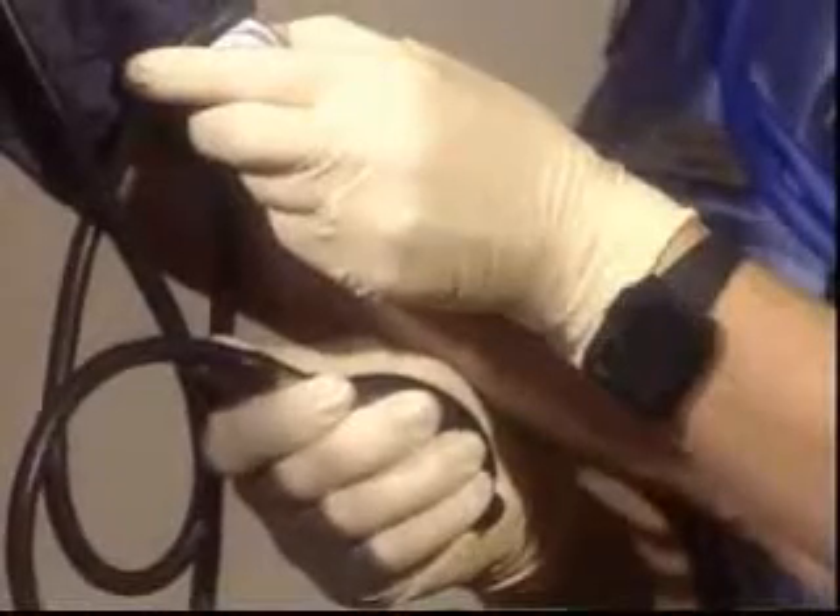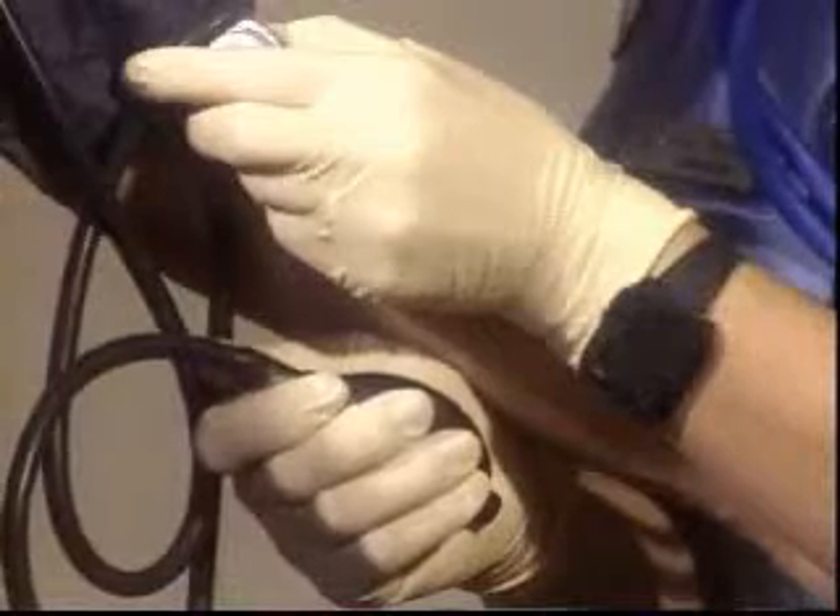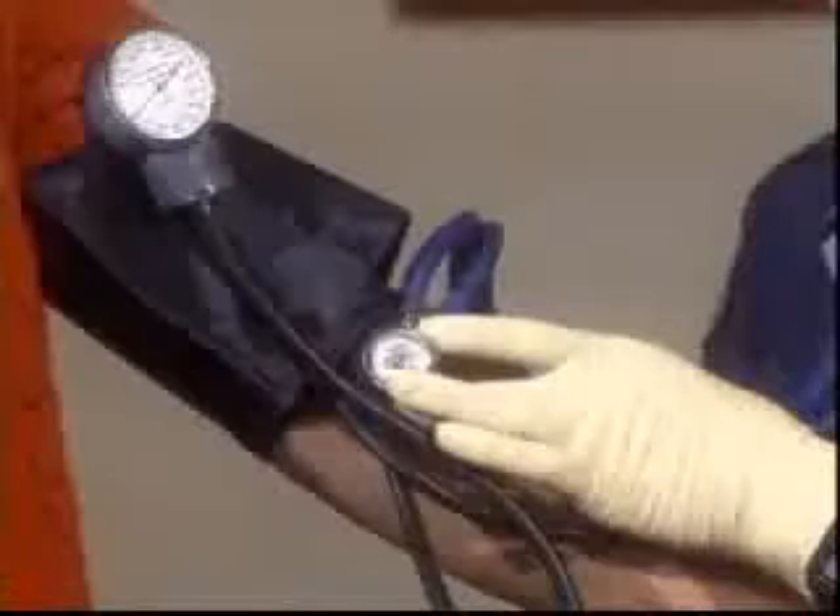Keep releasing the pressure slowly until you can no longer hear the sounds in the stethoscope. The cuff pressure reading at the time when the sound disappears from the stethoscope is called the diastolic pressure. This represents the pressure exerted on the walls of the arteries when the heart is at rest.